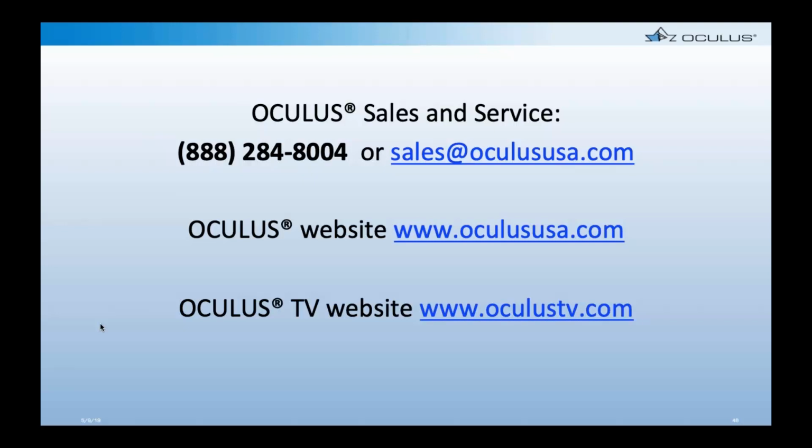Over time, as you become better and better at ortho-K and you want more control of that process, then you start looking at other aspects of the fitting process. One of the things that are important to note off of your map would be simply corneal astigmatism. If the patient has a certain amount of elevation difference in the mid-periphery of their cornea, that's going to dictate going to a toric design or a dual axis type design.